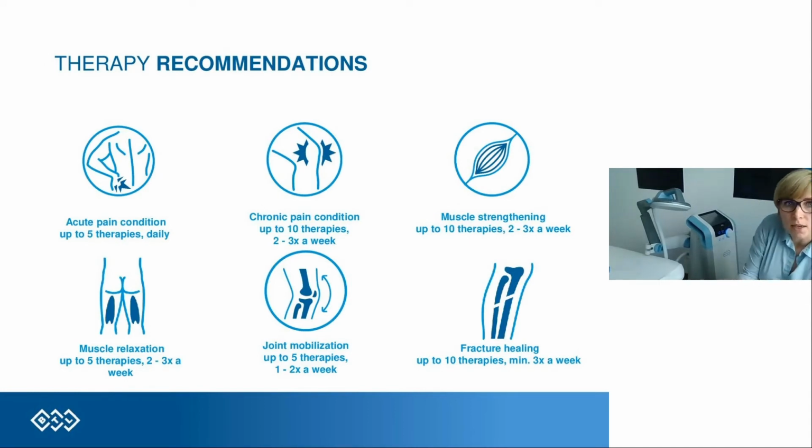So as you can see, we have very different recommendations regarding the patients we want to treat with this modality. So as I told you before, we can treat acute, chronic and subacute patients. So we have slightly different recommendations on how often we can use this device, and what is the number of therapies in one session.